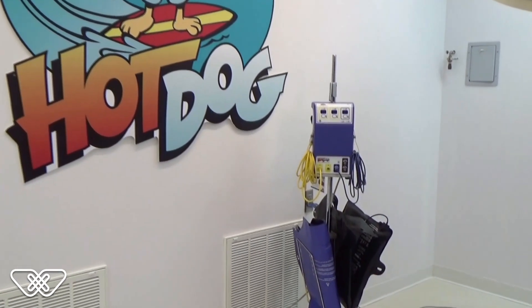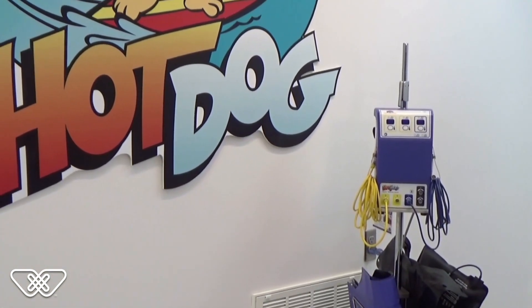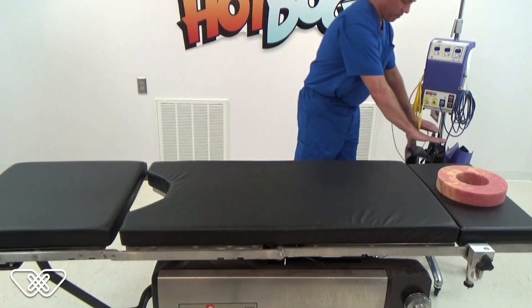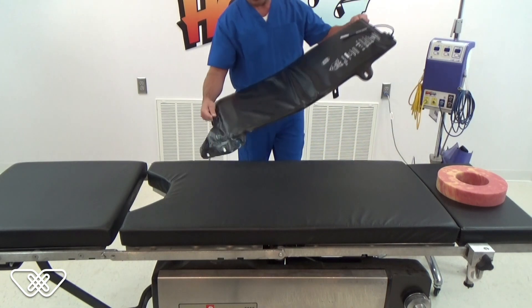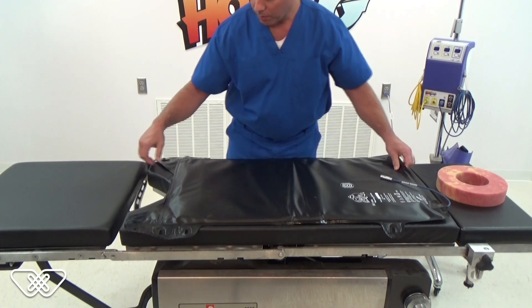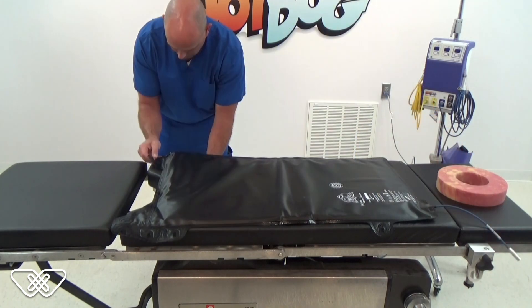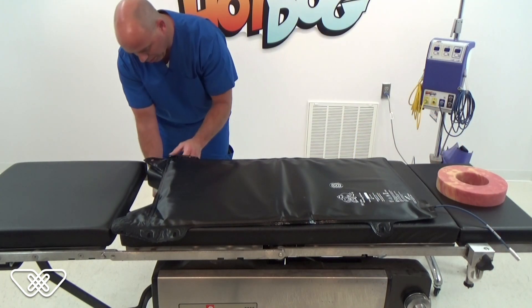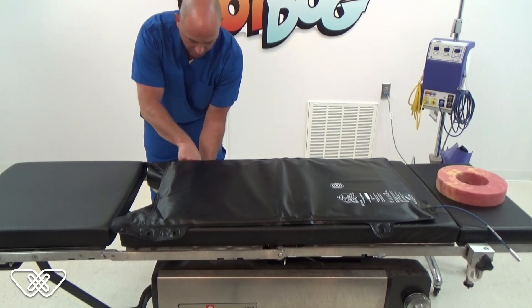Here's how to get started. Waffle Grip must be used in conjunction with the Hot Dog Patient Warming System. Place the U300 Hot Dog Patient Warming Mattress Overlay on the operating table pad. The mattress overlay should be aligned with the perineal cut-out of the OR table. Secure the mattress overlay to the side rails of the table using the six durable, reusable black straps.